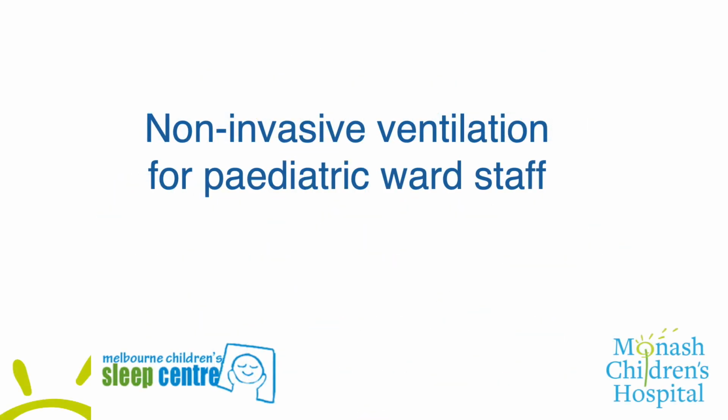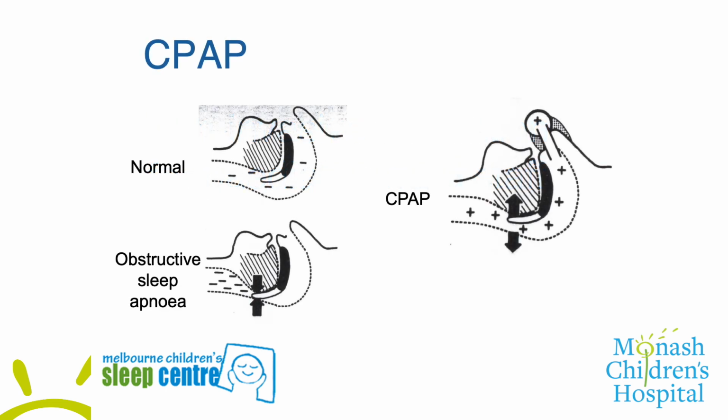CPAP and non-invasive ventilation are respiratory support modalities that can be used acutely and long-term to support a patient's breathing. CPAP provides continuous airflow to reach a set pressure. This can be delivered by multiple ways to the patient, including through a mask applied to the face. At home, CPAP is usually used for severe obstructive sleep apnea.